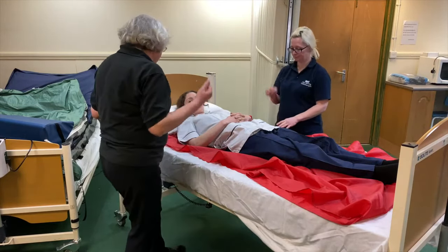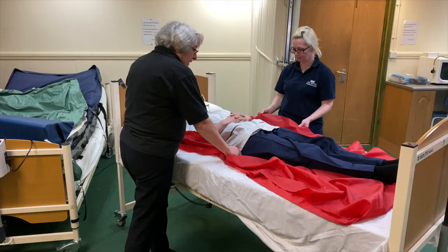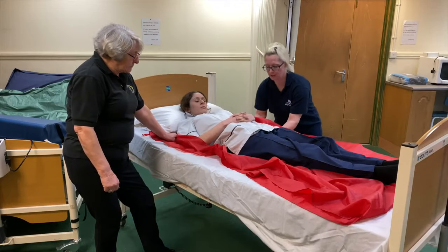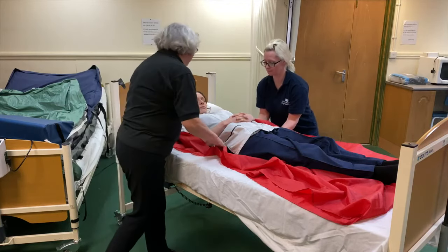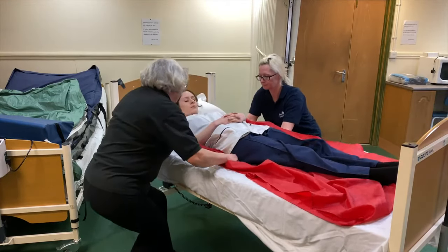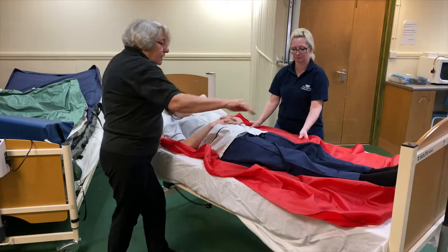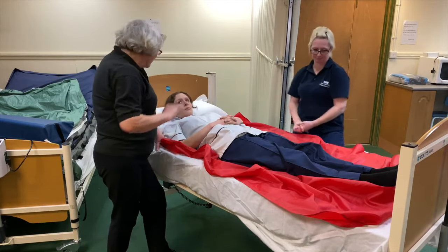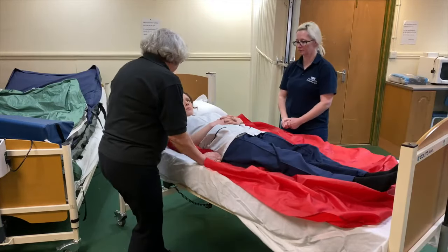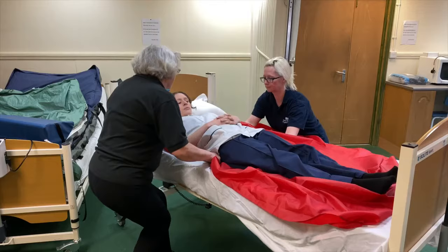So I'm coming with my stance, always remembering my bob, and taking hold of the top of the slide sheet and holding shoulder to hip. I'm going to fold the slide sheet up over Alice and just gently place my hands. Right, so ready and line. Okay, and she has slid. If maybe only part of the body slides, then I'll stay on this side because it's nearer, and Lisa would move the legs over if that was necessary. Okay, so I might just bring her a little tad closer to me. Are you ready? And slide.